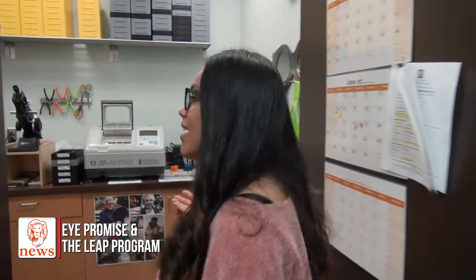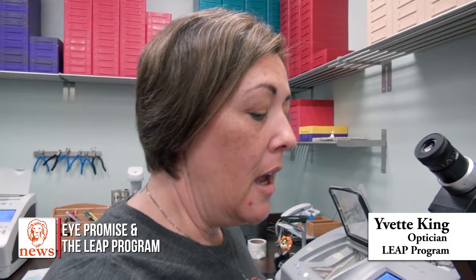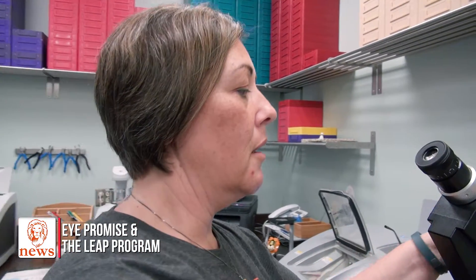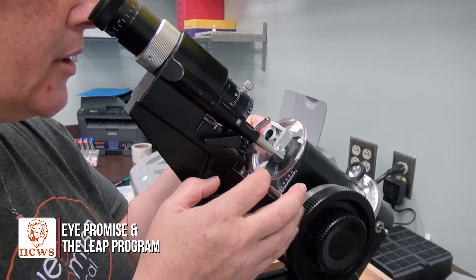We're going to take you right back into the lab where all the magic happens. Hi, I'm Yvette and I'm going to show you how to make a pair of glasses today. The first thing we do is spot our lenses by putting them in our lensometer, making sure they're at just the right axis, and then we mark them.